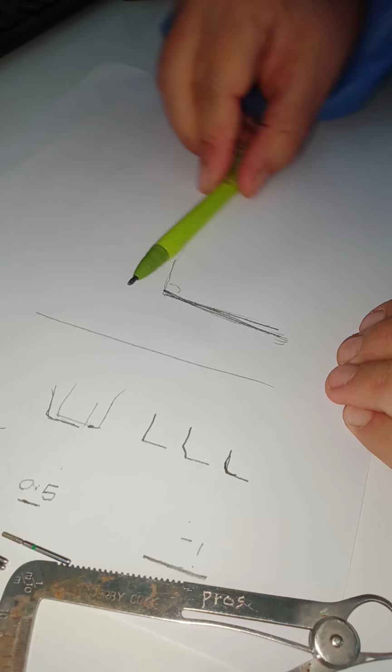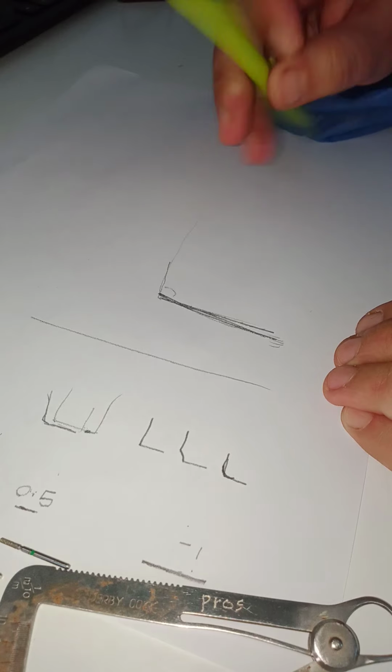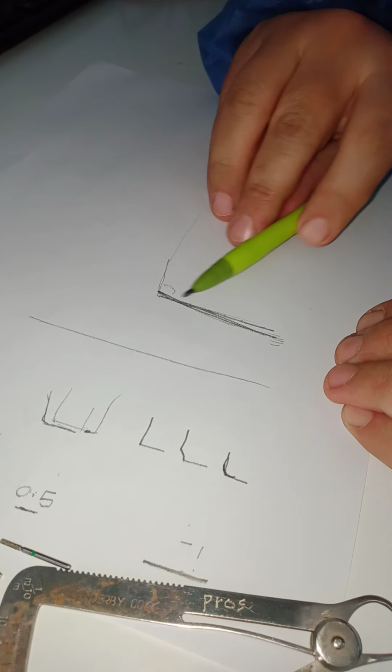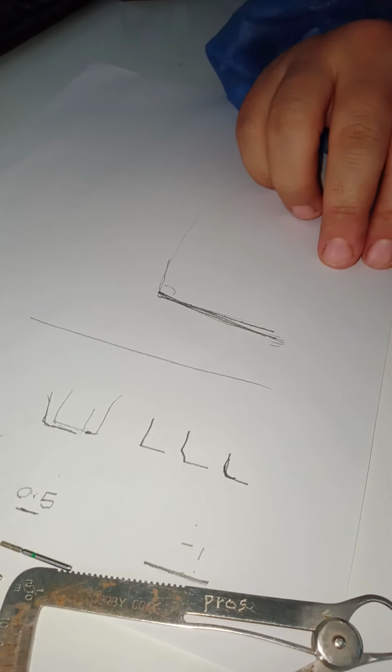So don't tilt to the outside while you're close to the axial wall. If you do that, you will create undercuts in the axial wall. So don't tilt the bur here, tilt it more towards the edge. So you will create this downward slope of the finish line.